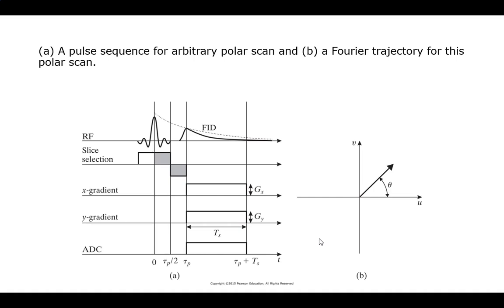So when you say walking along that vector in K-space? Yes. You're getting all the frequencies at the same time, I see. In the frequency domain, you're getting that whole measure because they're superimposed. In the spatial domain, it's being perturbed down it, and I'm calling that walking because the side at the lower side will be rotating at a lower frequency, the slower, and the ones at the highest gradient will be rotating at a higher frequency.